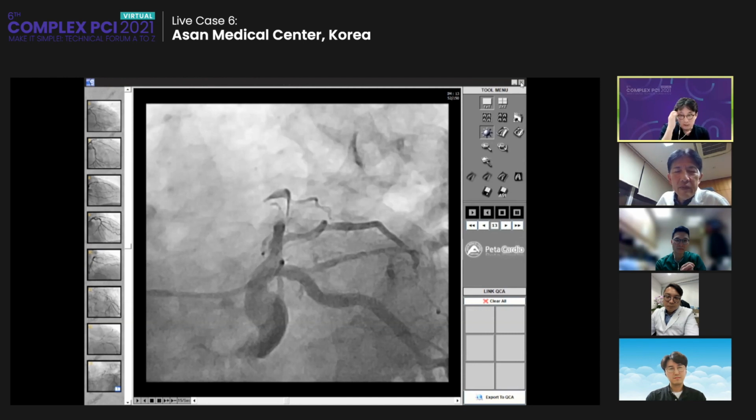So you told us that the thrombus is suspicious because of the cap morphology, right? Yes. I think we will see the other hospital's angio, but I think the previous operator did this procedure and deemed it not a CTO, and that was the failure. The reason for the failure of the previous one. So we can learn some learning points here.